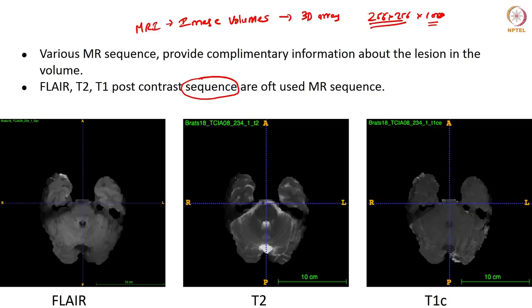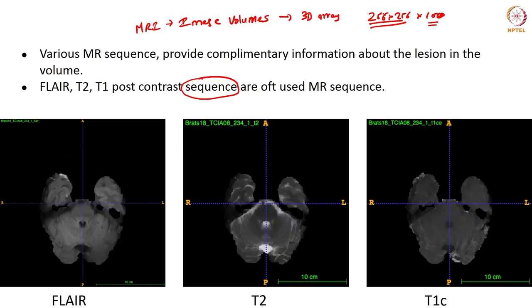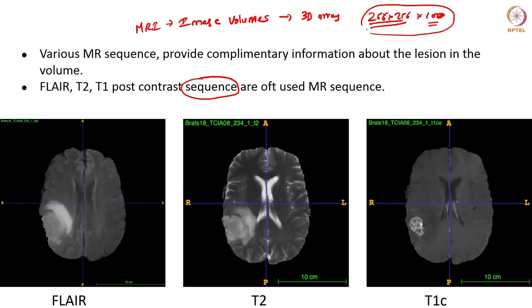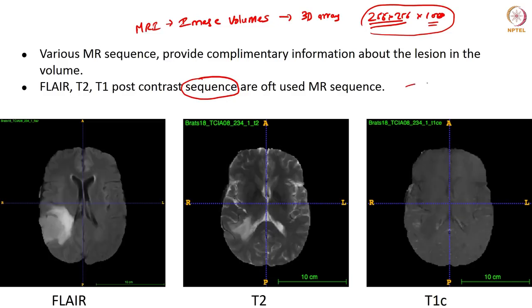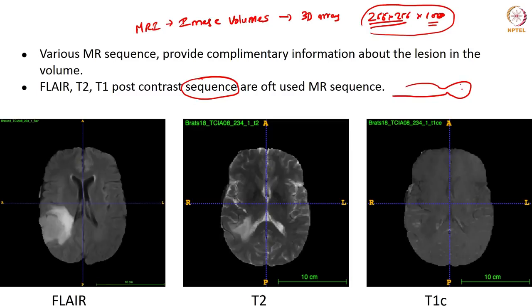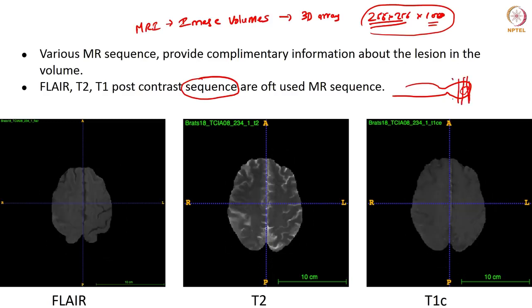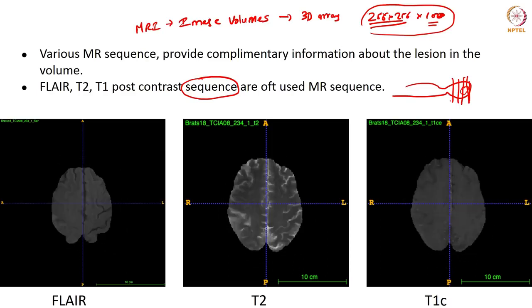So, for a typical glioma imaging session, you will acquire about 4 such sequences, and each sequence will have size of 256 by 256 by 100, where 100 is the number of slices through the anatomy. If you are wondering where that 100 comes from, let us say there is a typical human head right here. Brains right here somewhere. So, you would acquire slices which cut through the brain, or the head, so that you cover the entire brain or the entire head in this case.